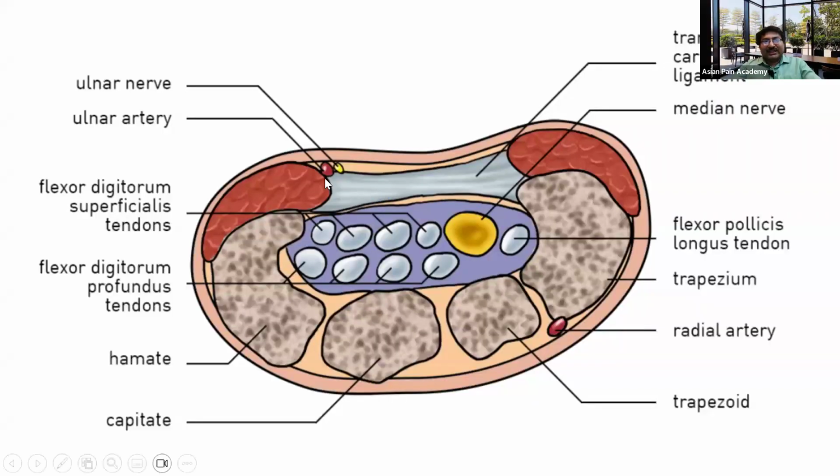Now there is another nerve, that is the ulnar nerve. But the ulnar nerve and ulnar artery usually lie superficial to the flexor retinaculum. Okay, so we will be seeing these nerves today in the class. As our volunteer has already arrived, I think you have understood these important nerves of the upper limb. Do you have any question? Okay, fine. So Dr. Roy will first be demonstrating the lower limb and the brachial plexus as well. Then I will come to the other nerves of the upper limb.